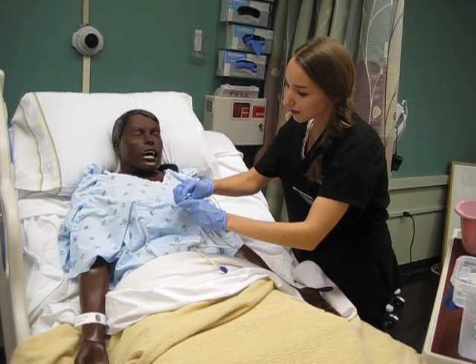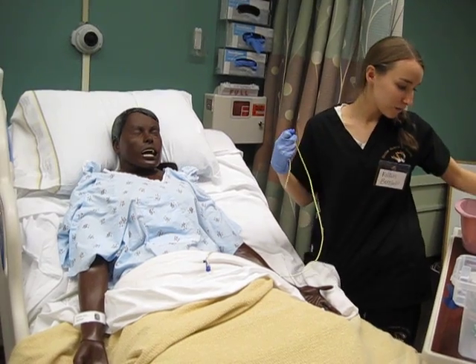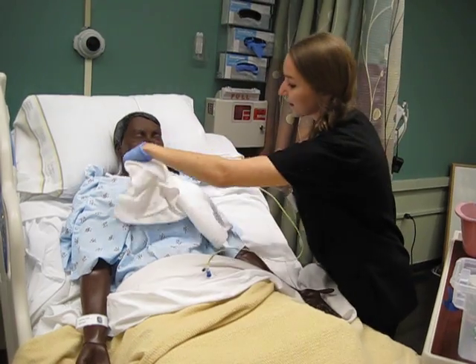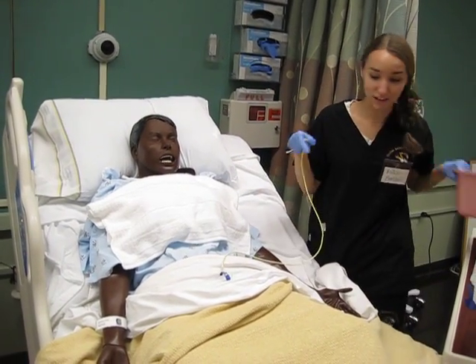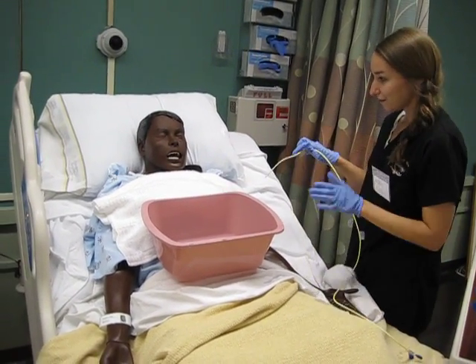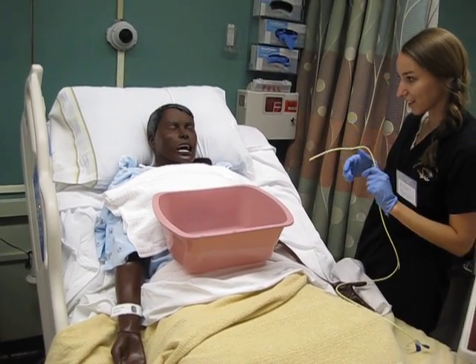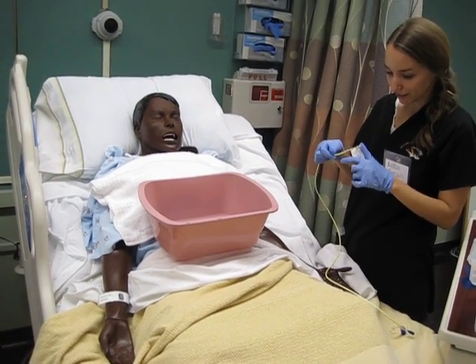This tube is going to go in through your nasal cavity, and at that point you're probably going to hit your gag reflex, and so you might need to gag or even vomit. So we're going to have this towel right here, and I have this basin — if you feel like you need to vomit, that's what the basin is for, so don't feel like you can't. You can let me know by wiggling your finger if you feel nauseous at all.